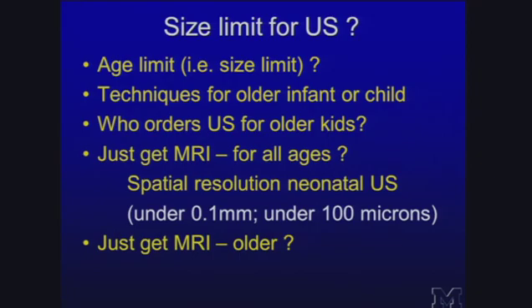Very often, if the child can cooperate enough, and you'll see in pictures if I can get them flexed enough, I can identify where the tip of the conus is. And I'd probably be able to identify whether or not the spinal cord is oscillating. But basically the conus tip, and if it's stone cold normal and high up in the lumbar canal, that might be enough information for the urologist.